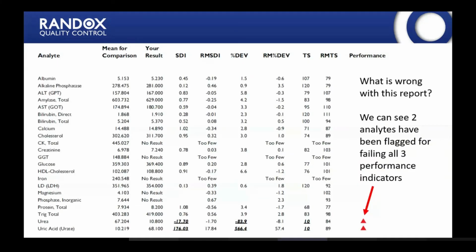So this is a different sample page. So we can see this time there are only 2 analytes that have been flagged, urea and uric acid. So I'm just going to leave that there for about 5 seconds, just while I talk, before I move on. So what do you think could be wrong with this report? So everything else has performed well for this particular sample, but these 2 have failed.